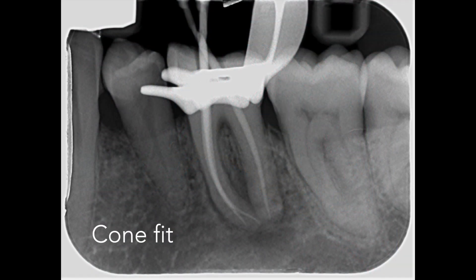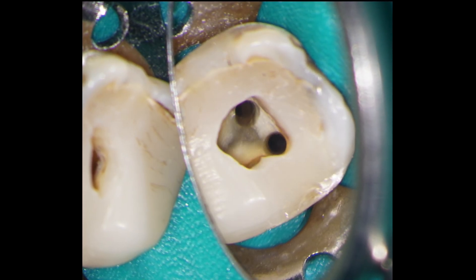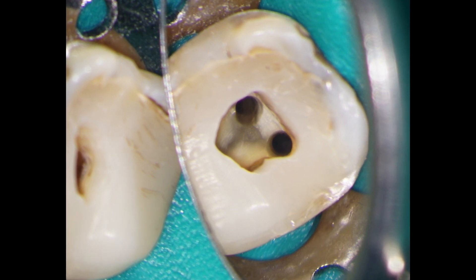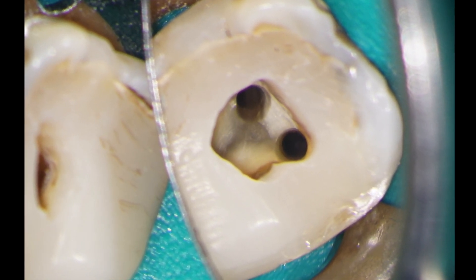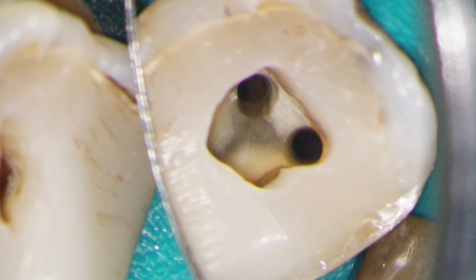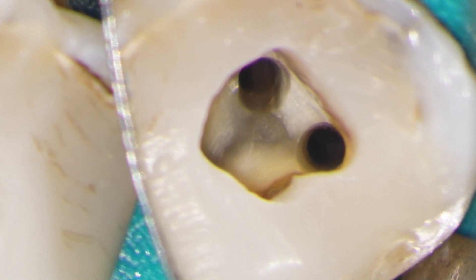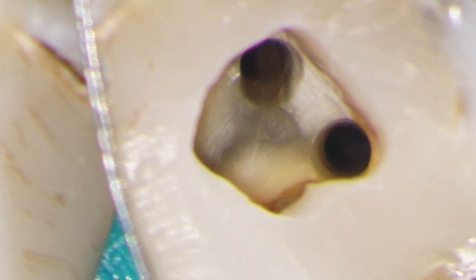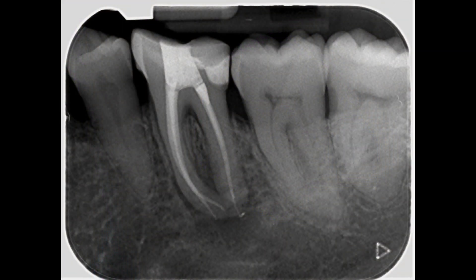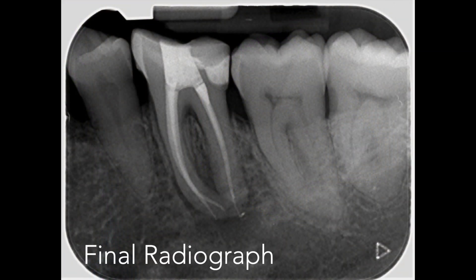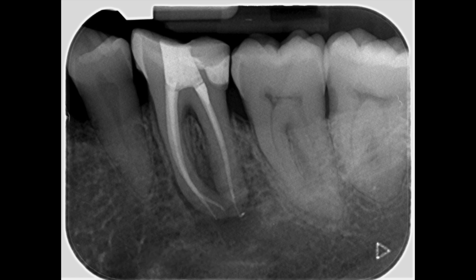After preparation, a cone fit radiograph was exposed. The canals have been dried prior to obturation, and you can see that the access cavity outline is irregular but follows the pattern of the pulp floor. The final radiograph shows a good coronal apical seal. In this case the tooth was obturated using a vertically compacted gutta percha technique. The first review will be in one year.